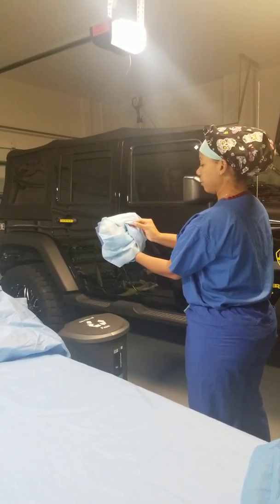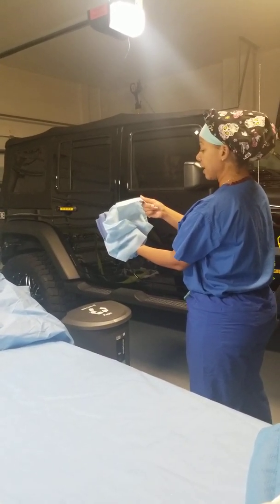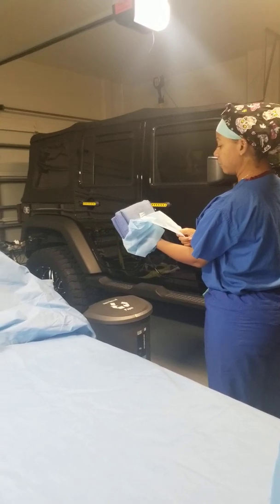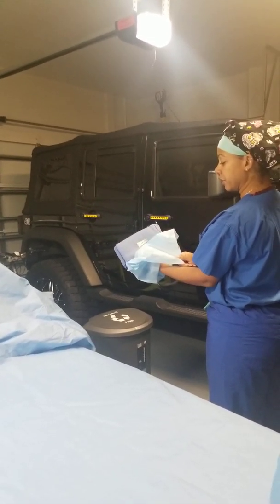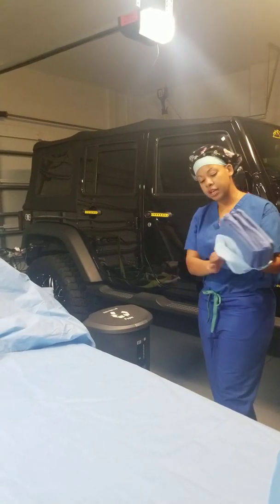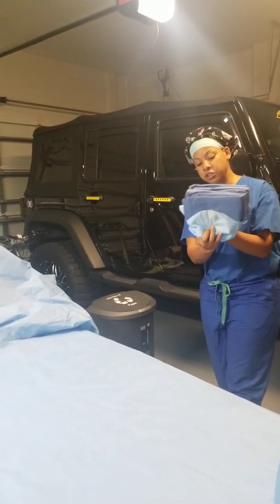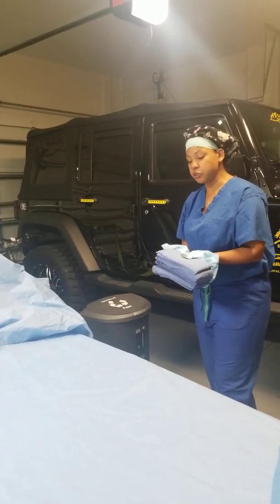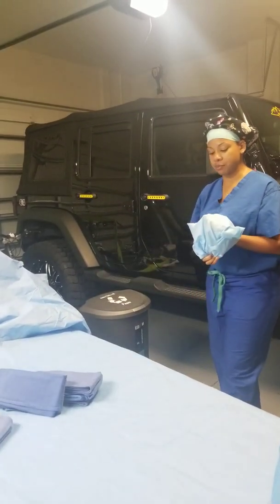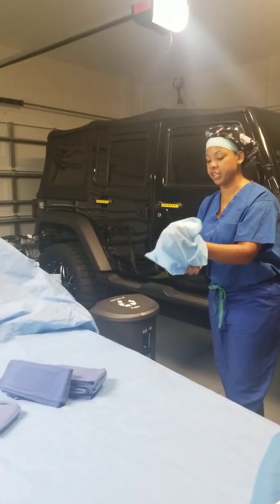Other side — out, under, secure it with your finger. For the very last tab, you're going to pull down. You can see your indicator, so you know it's good. Grab just a little bit, but you need to visualize what you're doing. Grab, and you're going to rock and drop — put it on the table and pull back. You don't want to reach over. You don't want to shake.